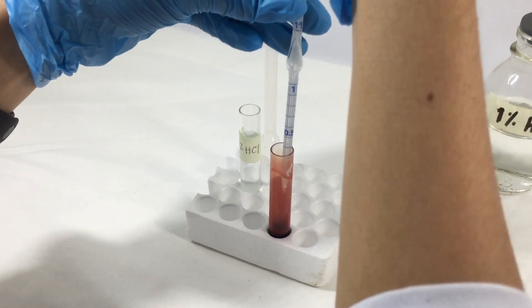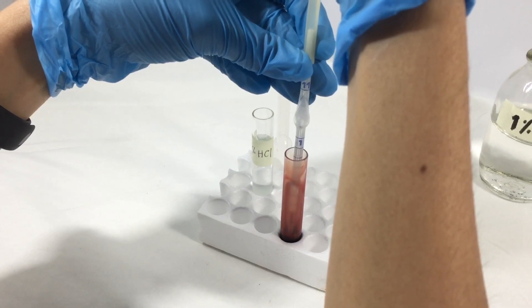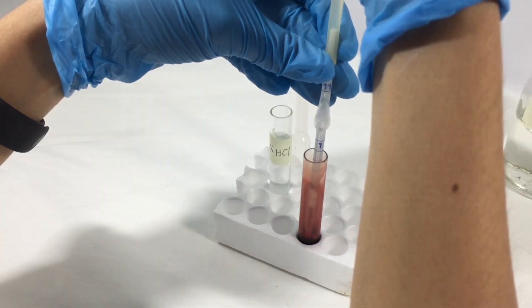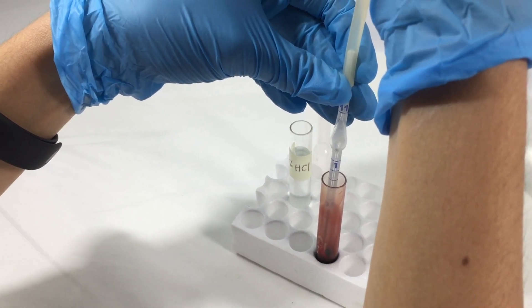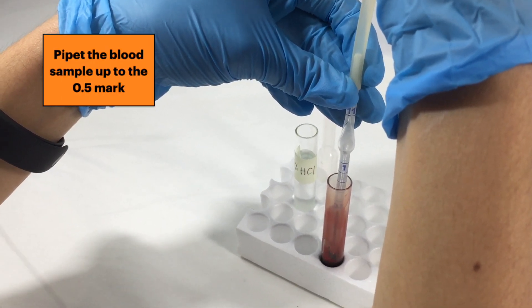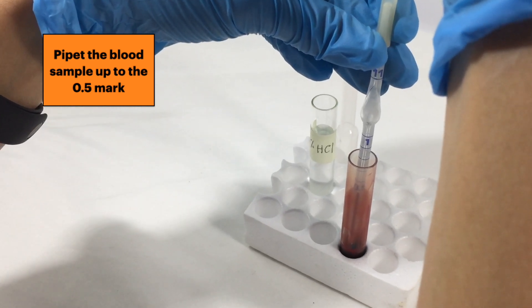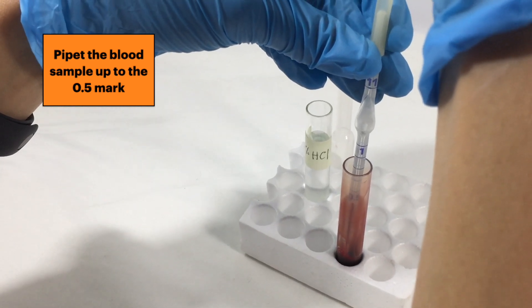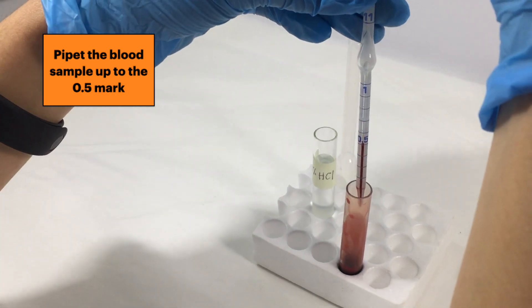Draw a sample of blood using the syringe of your pipette. Make sure that your sample only reaches the 0.5 mark. If it goes past this mark, you must repeat the procedure once again.